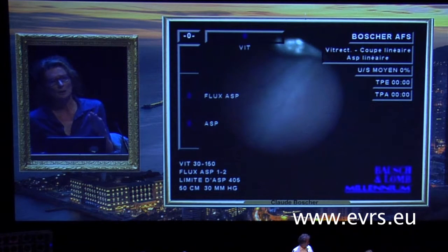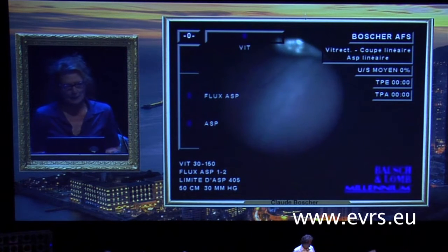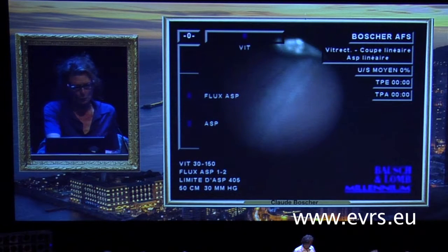The flow you can fix it, but it's the maximum, but it's linear control as well with the EVA machine. So you can also slow it down by moving your foot on the pedal. And then you have constantly, with a very small delay, what the surgeon wants to do according to the specific case. I picked up a case where the retina was not detached, not to add the problem of the retinal detachment, but just to show that even when it is attached, the vitreous viscosity, as you could see, entering the tip of the probe, is variable inside one eye, an individual's eyes.